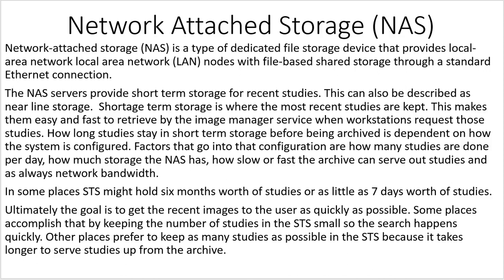Let's continue with the PACS components. Now we're going to talk about the Network Attached Storage, or NAS. Network Attached Storage is a type of dedicated file storage device that provides local area network or LAN nodes with file-based shared storage through a standard Ethernet connection.